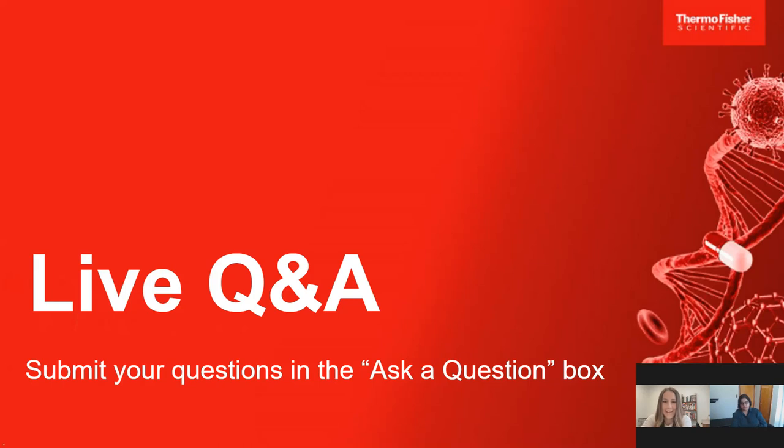Thank you. Another question related to drying. How much do you need to dry the tissue on the slide after each wash step? I recommend there is no need to excessively dry the tissue. Just remove the excess liquid from the slide. What I personally prefer is to use my hands and flick it so that all the excess liquid comes down. That much drying is required, not more than that.